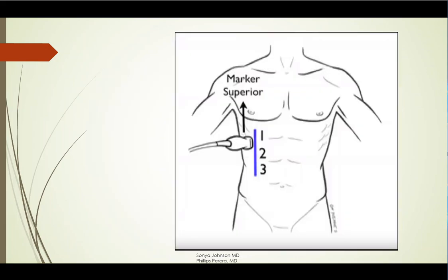You want the probe in the mid-axillary line. This is a hepatorenal view or Morrison's pouch, and what this view represents is the interface between the liver and the kidney. You're looking at that potential space, and that's what's called Morrison's pouch. With the right upper quadrant — and with the left as well — you need to get various views. You can't just stick the probe on the abdomen and get one view; you need to move the probe up and down and get all three views.